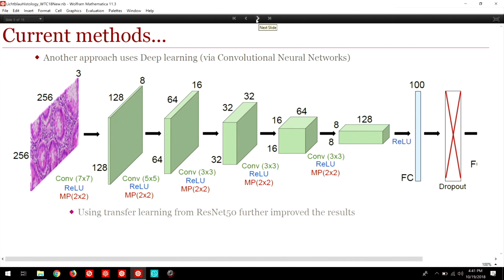When presenting those results, I had the opportunity to meet someone who was using deep learning, and we started a collaboration. We tried to apply a convolutional neural network to our data set, which led to better results, somewhere around 91%, after tuning a lot, but still not overfitting.